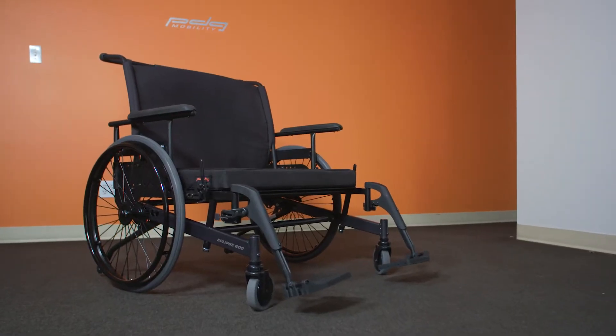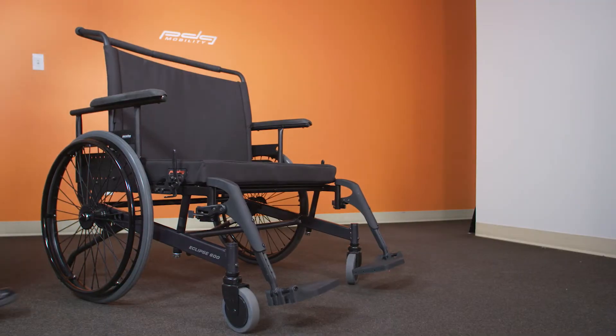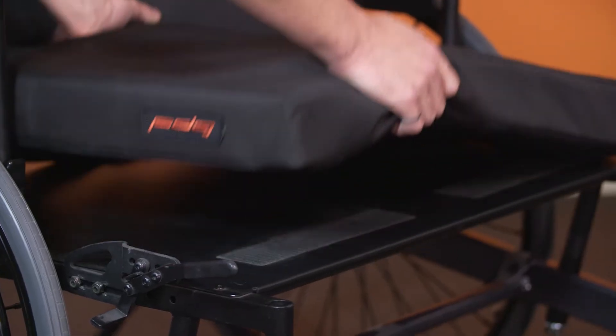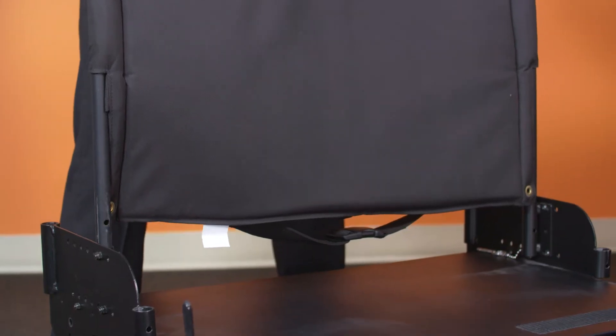The Eclipse seat height can be increased or decreased depending on the chair configuration. Begin by removing all of the chair accessories including the front rigging, the seat cushions, the armrests, the wheels, and the backrest.